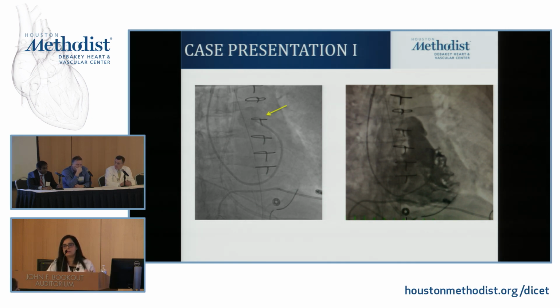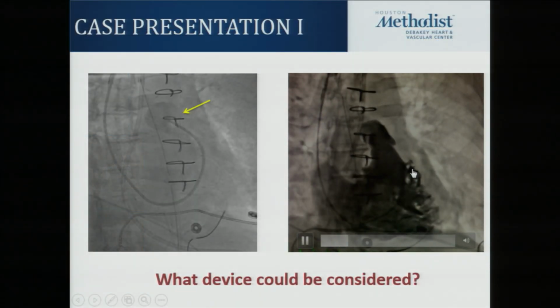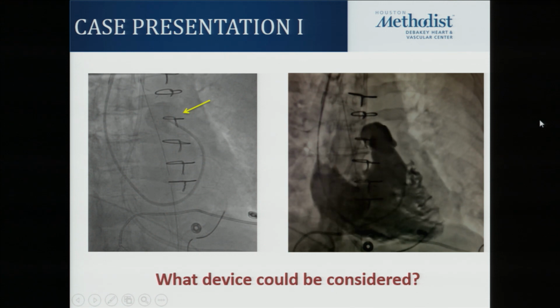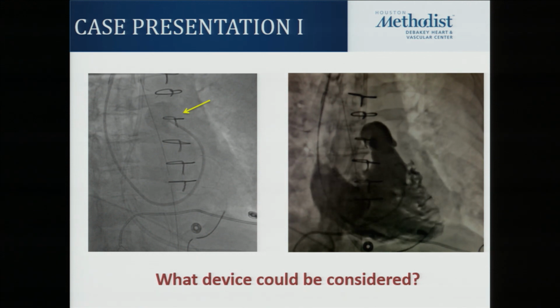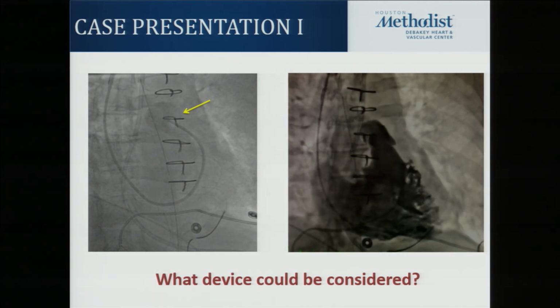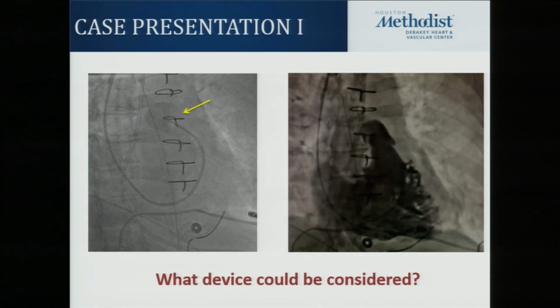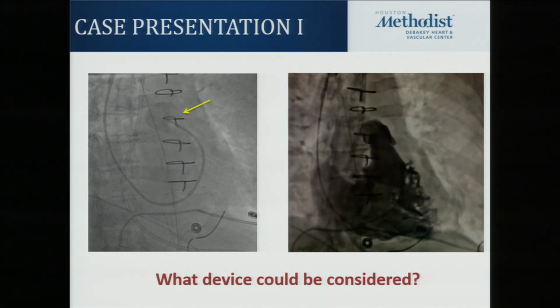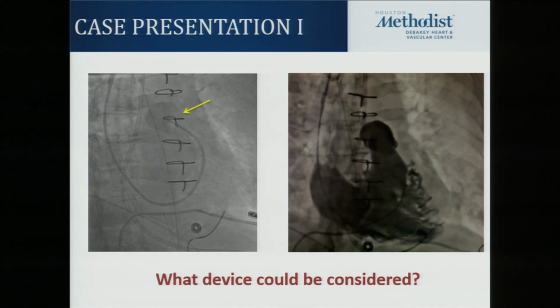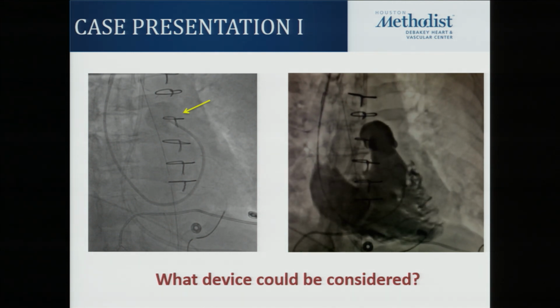So at that point, we knew there was some kind of obstruction that we're dealing with. Can we play the image, please? As you can see, everybody can see that there is contrast. The RV is contracting, but actually there is no flow beyond the cutoff point that you see, and there is no flow to the lungs in the pulmonary vasculature. So this was a unique situation where, not only did I see high resistance, I saw complete obstruction. Which, if you think about it conceptually, high resistance behaves like that physiologically, but here you're seeing complete obstruction. There's actually no flow.